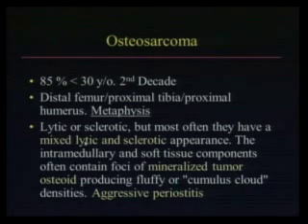So usually the lesion is sclerotic with lytic areas, and you will see osteoid matrix associated with this tumor. So the matrix is another very important thing that you have to recognize in order to make the diagnosis of a bone tumor. So my question is, can you differentiate benign osteoid matrix from malignant osteoid matrix? And the second question is, can you differentiate benign chondroid matrix from malignant chondroid matrix? Not chondroid, it's very, very good. Chondroid, benign and malignant are similar, but osteoid.